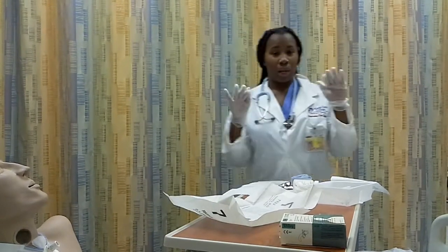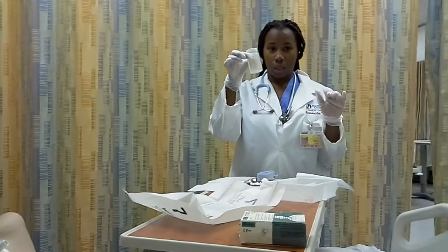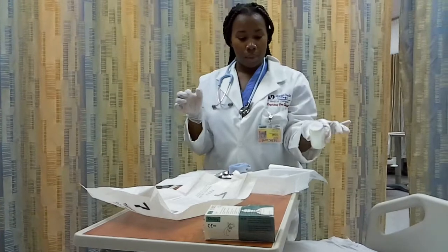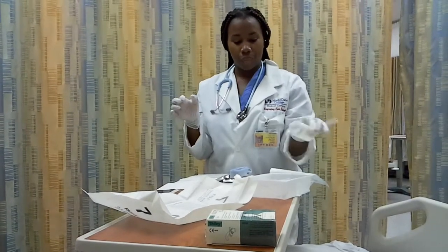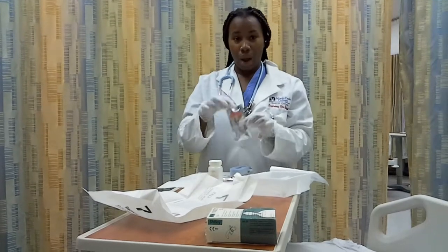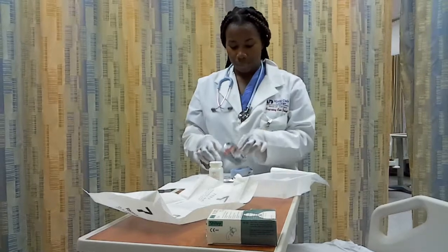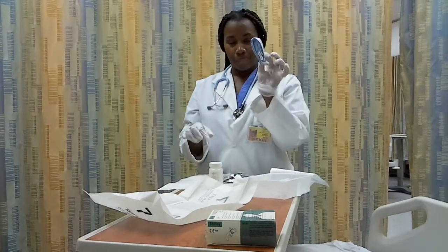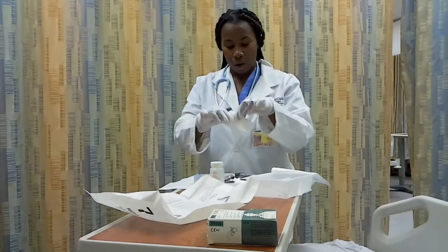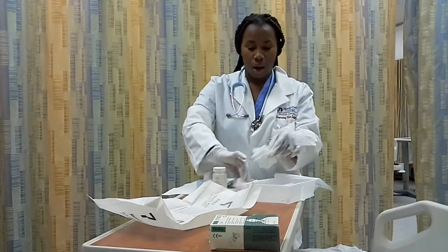So next I'm going to point out to you everything that comes inside the trach kit, which is my saline water, my sterile water. I'm going to do 2 compartments of sterile water, this one and this one. Next, I have my 3% hydrogen peroxide. Okay, I'm going to put that in the big compartment. I also have my trach collar, my 4x4 sterile gauze, and I also have my 4x4 pre-cut gauze.